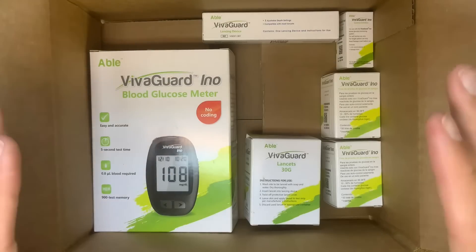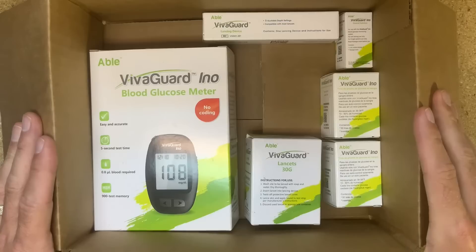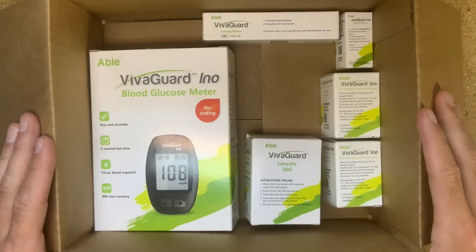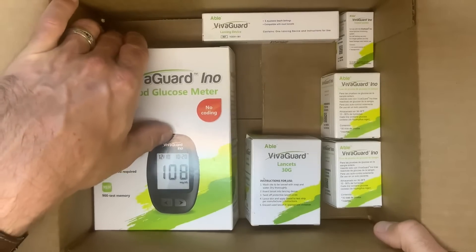I'm in the warehouse at Diabetic Outlet. All of this comes as a bundle, a package, and it's a good deal and it's a good meter. So we wanted to make a video to show you what it is.